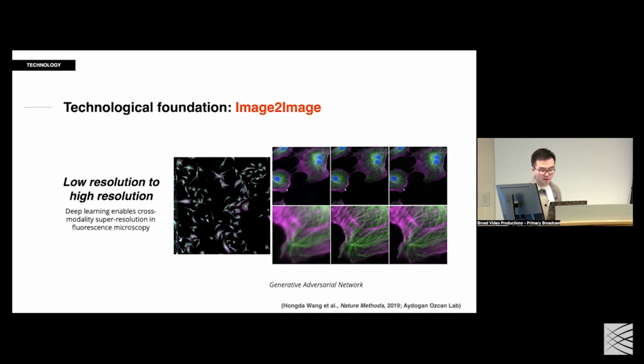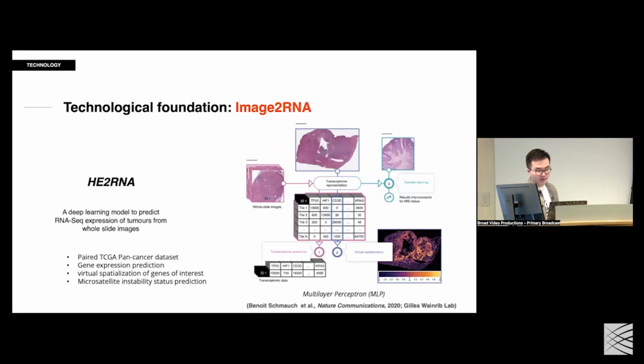So this is a very exciting time as we think about how to combine these machine learning tools to really scale up the tissue mapping effort. And then there are more clinically relevant studies by this group. I think it's actually a company now that developed this HE to RNA framework, where you can predict the RNA-seq data at the whole slide level from HE staining.